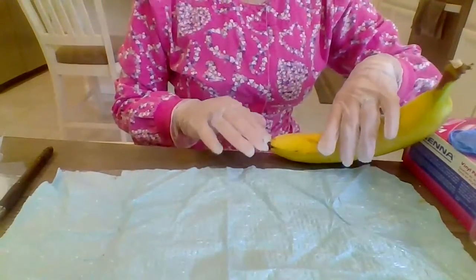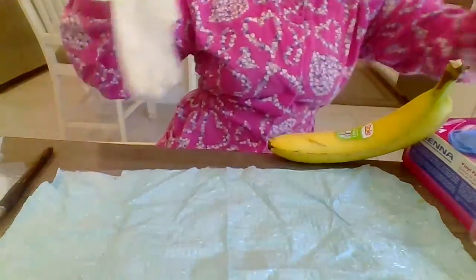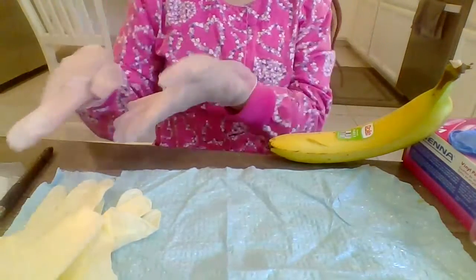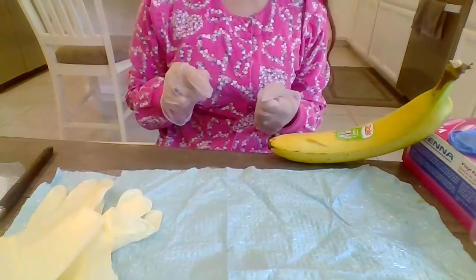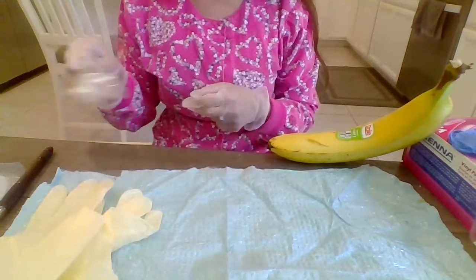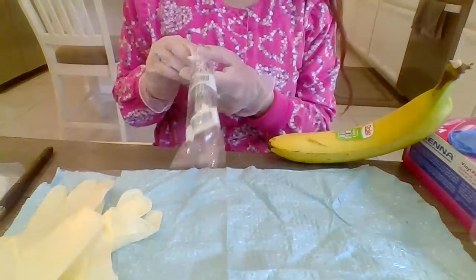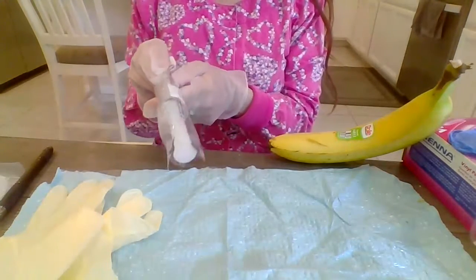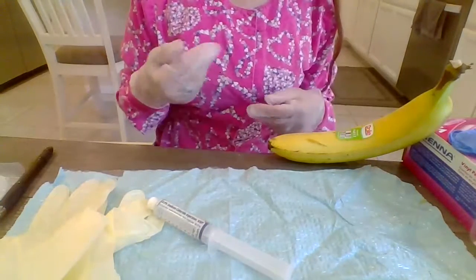And I have a pair of sterile gloves. It comes with the sterile kit that is already there. I didn't touch it. For the IV insertion, I have selected the saline flush. Without hovering over the sterile field, I'm going to open it and drop it in the IV sterile field.